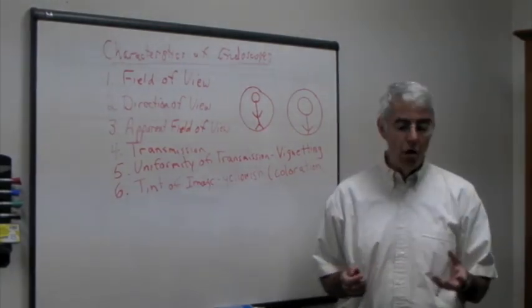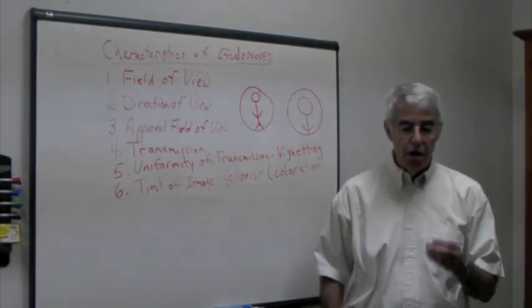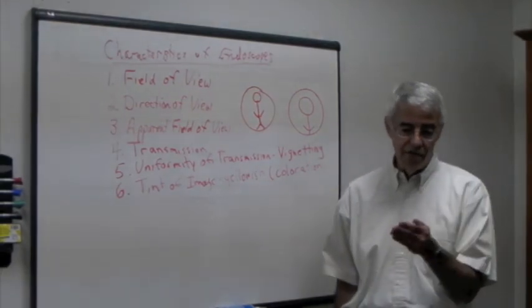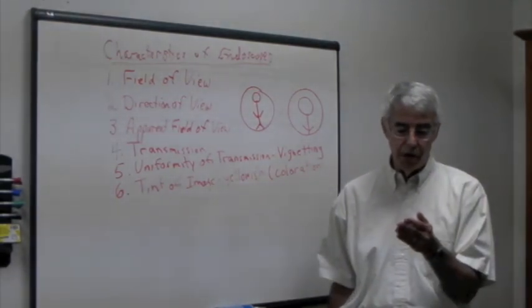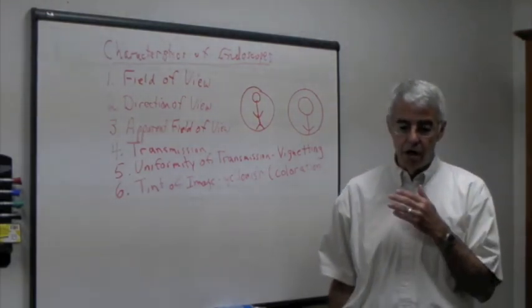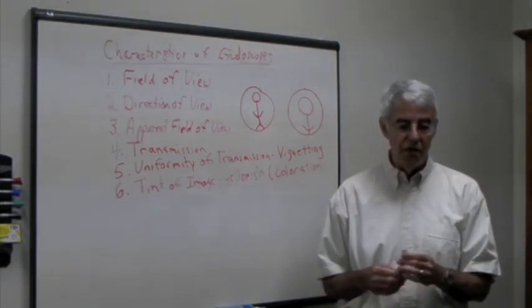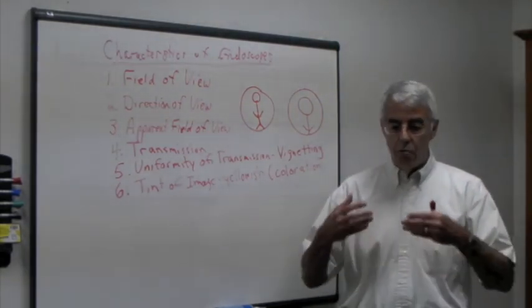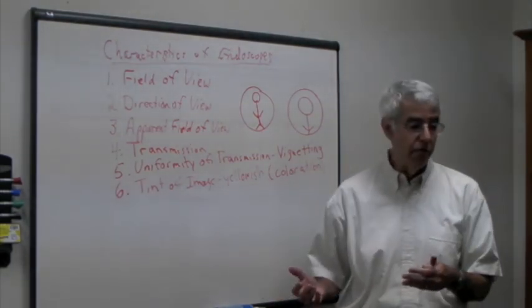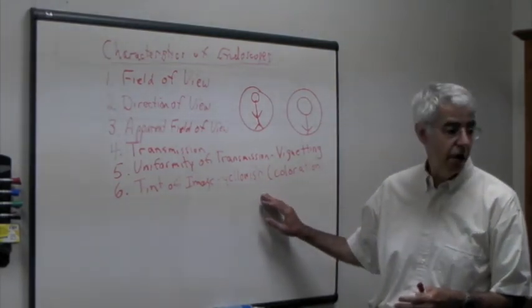The anti-reflection coatings on the individual lens components in an endoscope matter: when you have 30 air-to-glass interfaces and you're off in your anti-reflection coatings by a very small amount, it can drastically adjust the tint of the image. If the repair organization puts in new lenses and they don't have the proper anti-reflection coatings, you can have the effect of having a yellowish image.